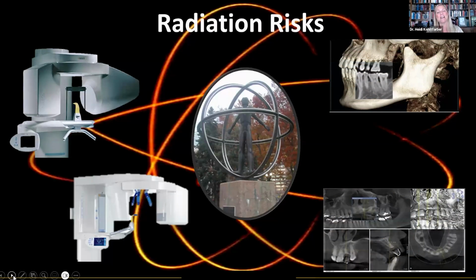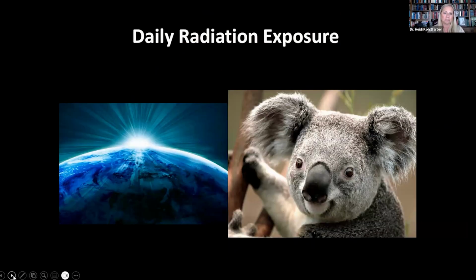But we're first going to start with our radiation risks. That is a concern that our patients have. They're concerned about maybe in utero defects. They're concerned about cancer risk and that sort of thing, as well as some of our staff in our offices. They're very concerned about that. So let's just talk about that right off the bat.